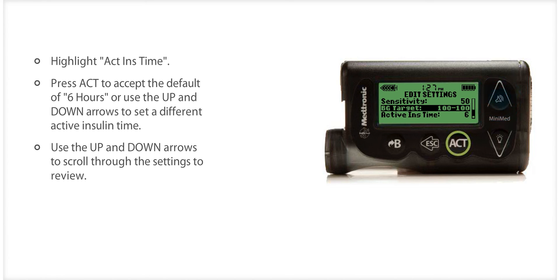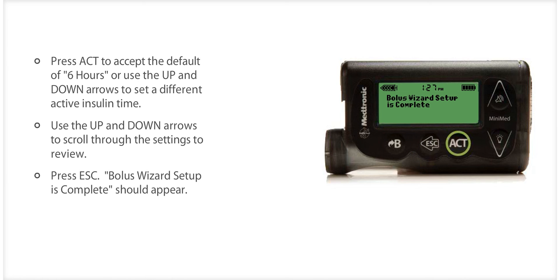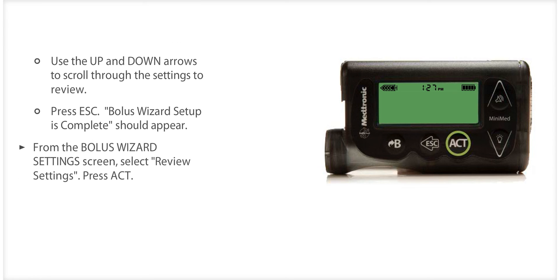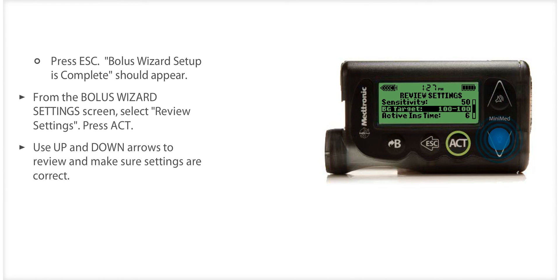You will now see the Edit Settings screen displaying the Bolus Wizard settings. Use the arrows to scroll through and view all of the settings. You have now completed programming the Bolus Wizard feature. Press ESC and the words Bolus Wizard Setup is Complete should appear. If the programming is not complete, a Missing Info message will appear — follow the instructions to fill in the missing information. Take a moment and practice programming your Bolus Wizard now. Before moving on, it is a good idea to review your Bolus Wizard settings. To get to the Review Settings screen, select Review Settings on the Bolus Wizard Setup screen and press ACT. Scroll through the settings and make sure they are set correctly. When you are finished, press ESC.